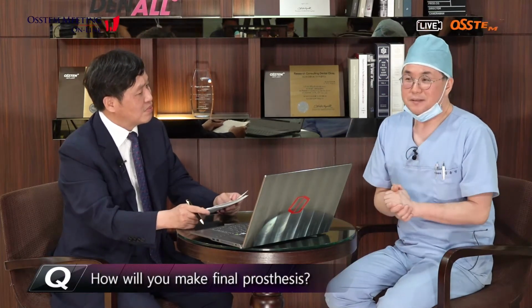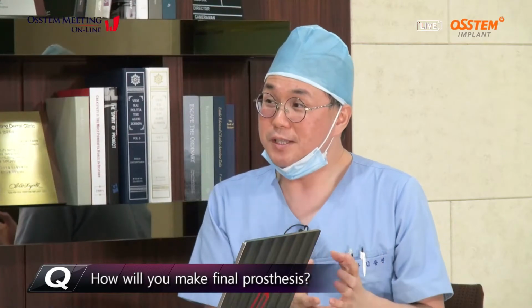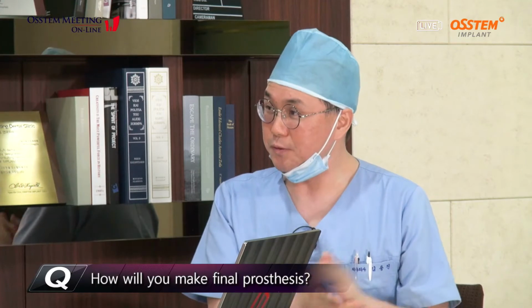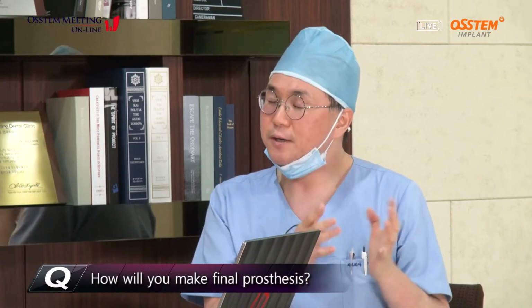So the main reason why I planned the digital guided implant surgery for this patient is to make a one-piece type prosthesis. So by adjusting the implant angulation, I will be able to make a one-piece type final prosthesis.